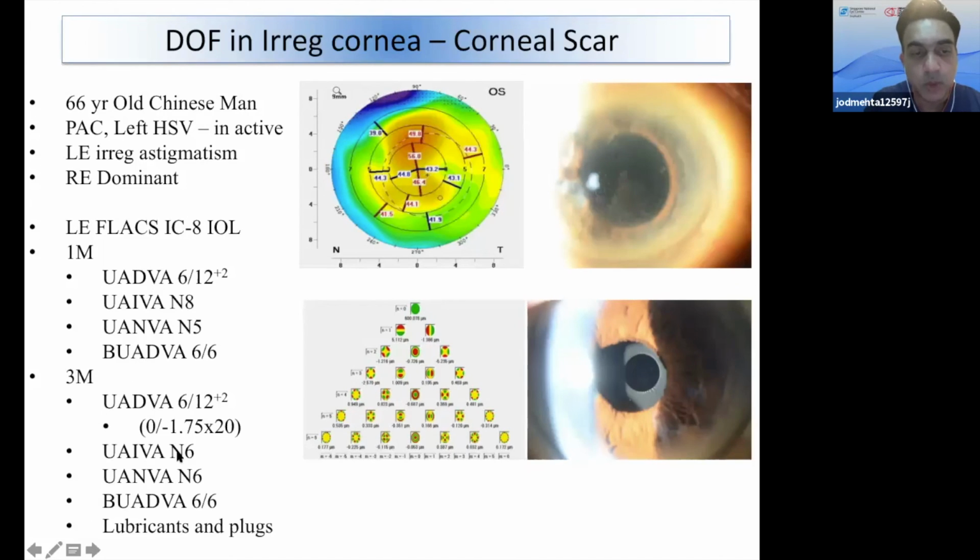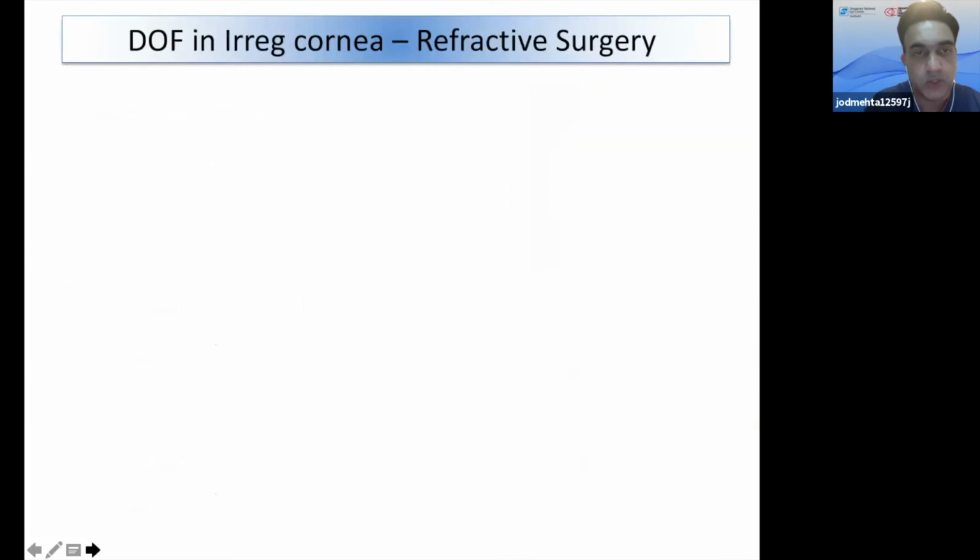At 3 months post-op, he settles in quite well. I do find that, especially with these patients with ocular surface disease, you must treat the ocular surface. So he has a punctal plug inside the eye and lots of lubricants to help even out the ocular surface, especially if they have induced irregularity, because it will affect the quality of the vision that he's able to read from this side. But he's got a pretty reasonable result, even though his hemimeridian is almost about 9.6 diopters across the central visual axis.